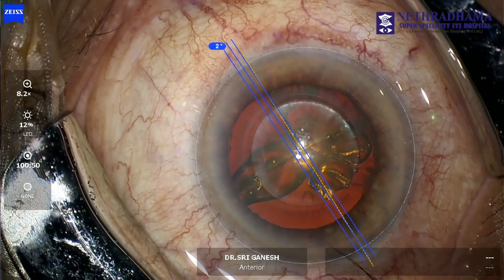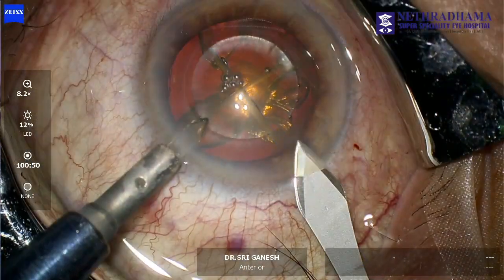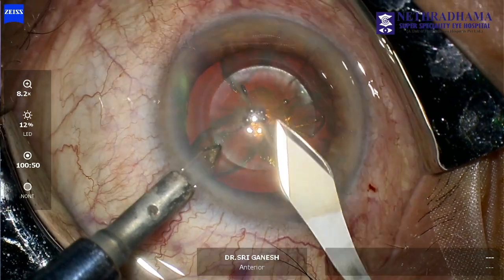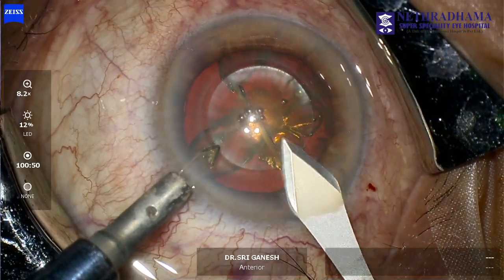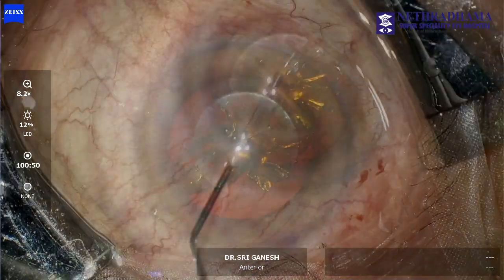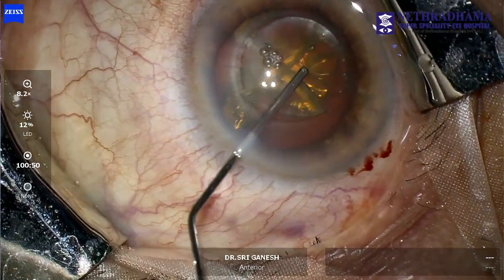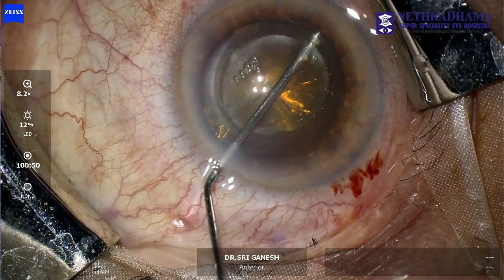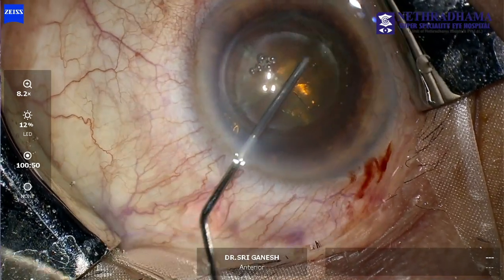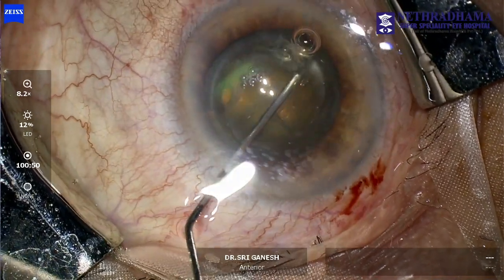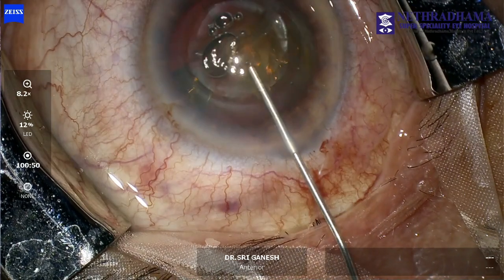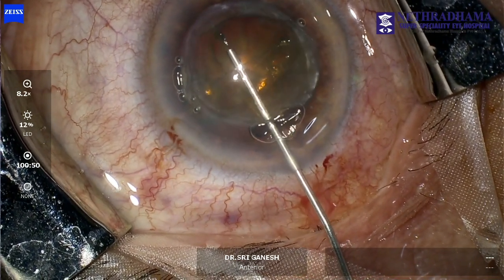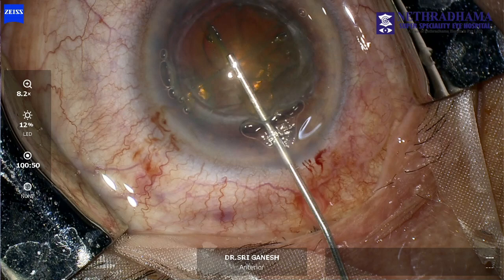This patient was posted for femtosecond cataract surgery with a Toric IOL. You can see that the femtosecond laser is already done. We make the entry and you can see that hydro dissection is being done and viscoelastic is put into the anterior chamber.